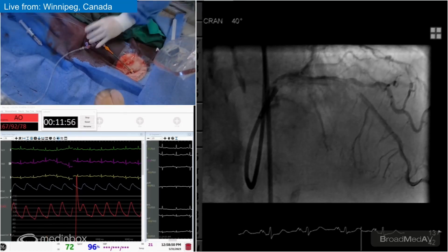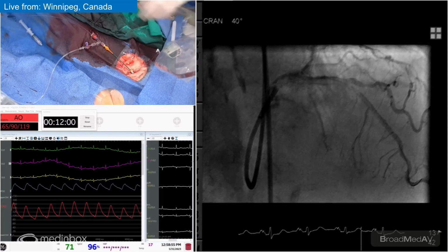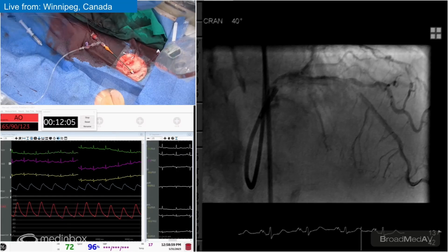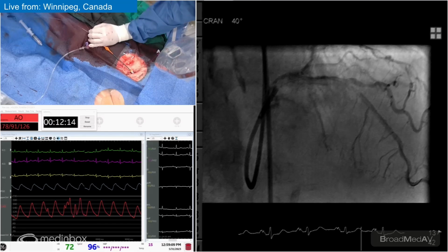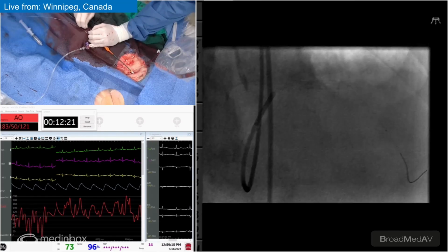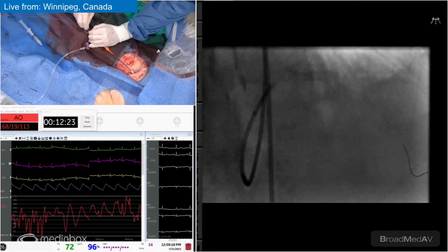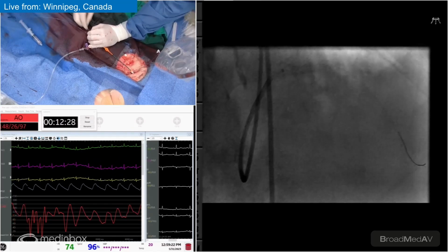Sure. Let's get the balloon at the tip in the wire. What I'm trying to do is get the guideliner tip not to have any tip-stent interaction. What we'll do is go up to about 4 or 5 atmospheres, get the tip of the guide, have a nice transition into the vessel. Yeah, it torpedoes the guideliner. Exactly. Surprisingly, it softens the entry. So what I'll try to do is get a guideliner where I can see the tip, leave it there, see how softy goes in.